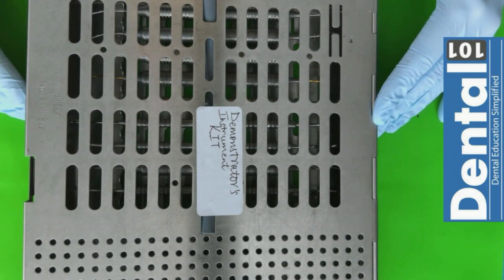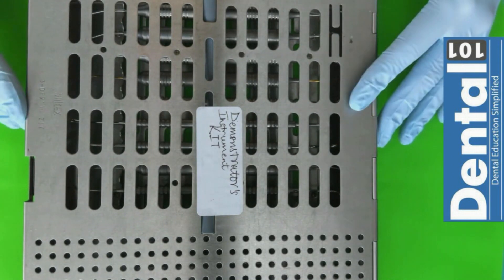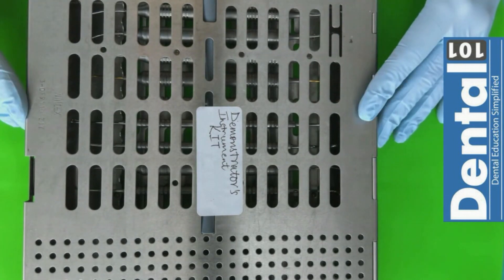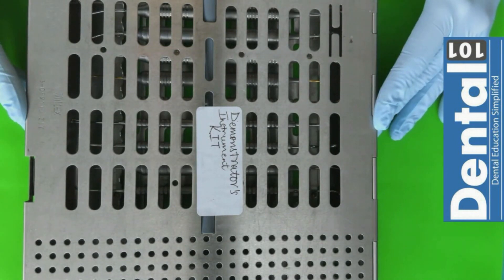In previous videos we have seen that we are going to have some instruments on our bracket table and also some instruments in our trolley. This cassette that you are seeing right now contains the restorative instruments that you are going to use for your tasks. This cassette is going to be on top of the trolley next to your working station.